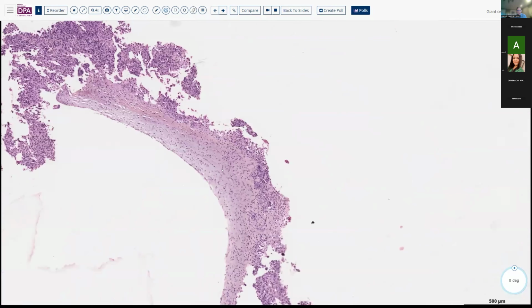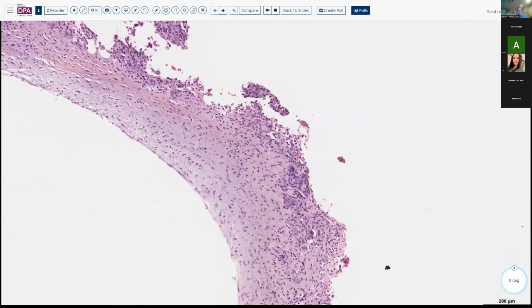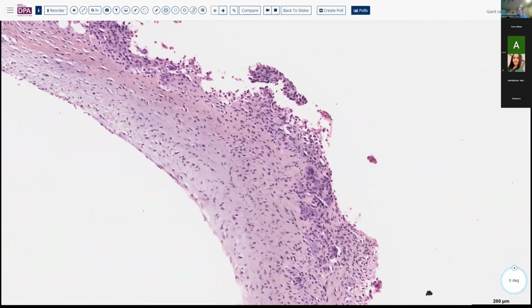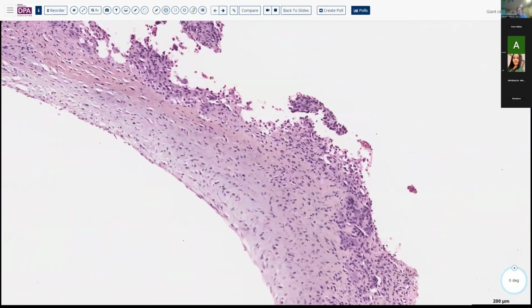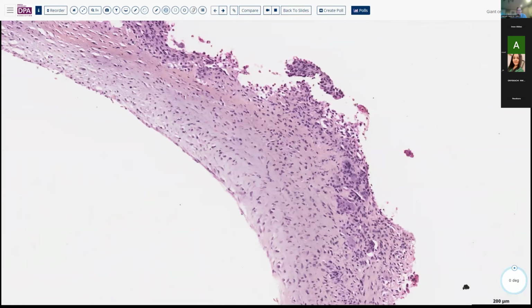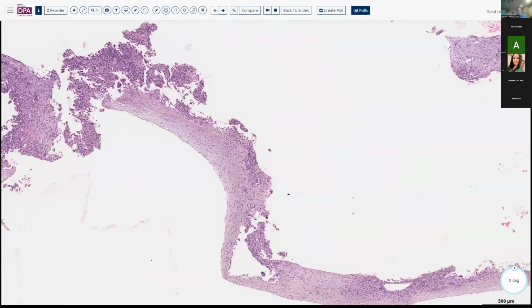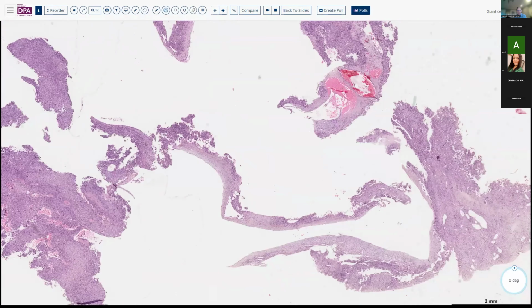As you know, sometimes aneurysmal bone cysts can occur in this location, either as a primary lesion or as a secondary lesion related to underlying giant cell tumor or other lesion. So we may have that sort of a component going on based on that cystic tissue there.